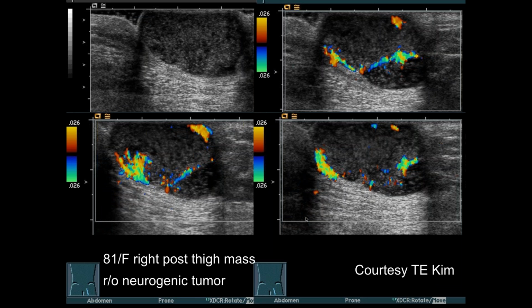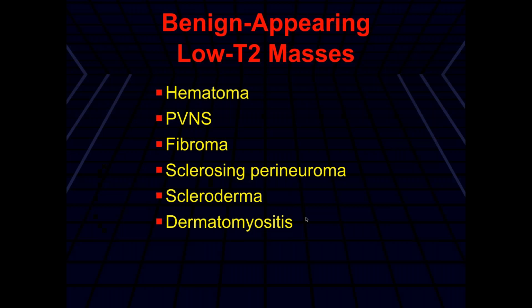Okay. Dr. Kus, can gout be multifocal like this? Gout can look just about anything. So if they're calcified, then you can put gout in that category. These are the non-calcified ones. Okay. So those can involve the joint spaces or the soft tissues? Gout can. No, of this list, because you showed examples. Yeah, these are primarily soft tissue lesions. They can involve the soft tissues around the joint, but they're soft tissue lesions.